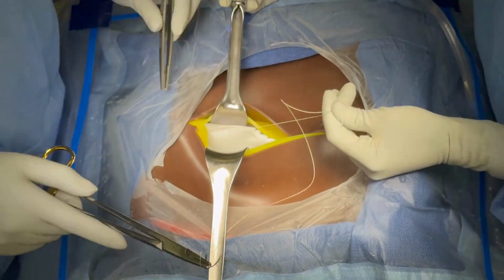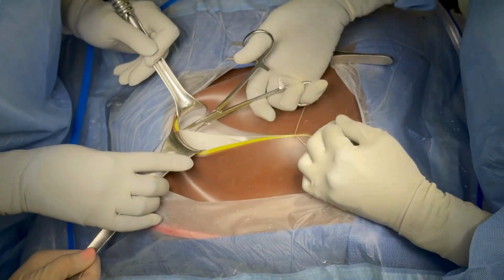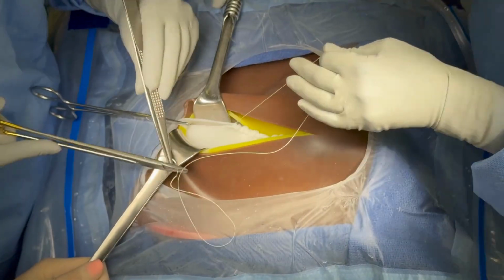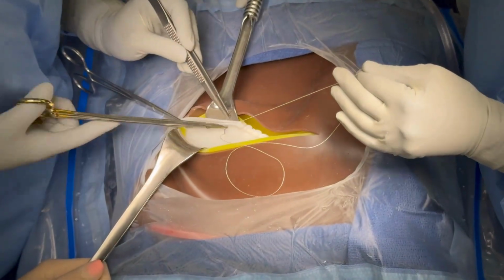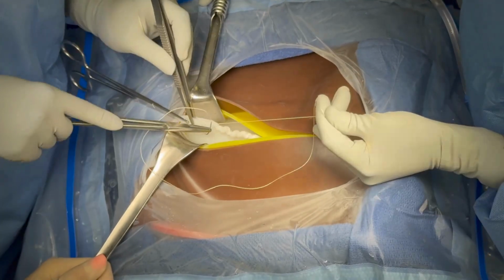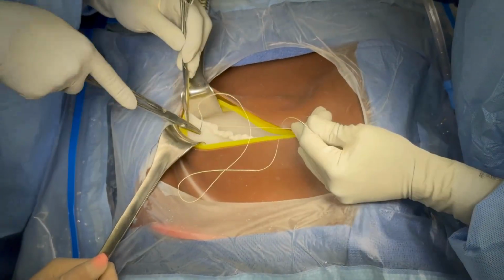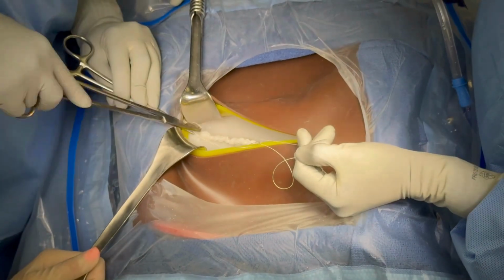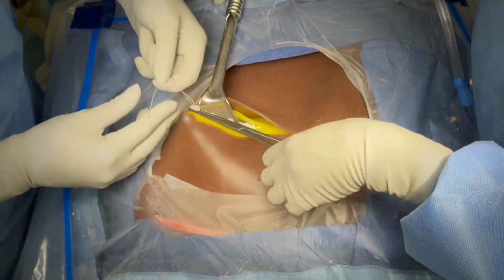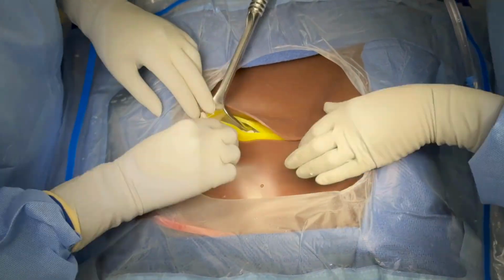To aid in visualization and closure, the surgical assistant may use a Coker clamp to grasp the opposite edge of the fascia. Some surgeons prefer to elevate the fascia by pulling upwards on the Coker clamp, helping to lift it away from underlying structures and reduce the risk for inadvertent injury. Once the fascia is fully approximated, the suture is tied, and the surgical assistant removes the Coker clamp as the first knot is cinched down.